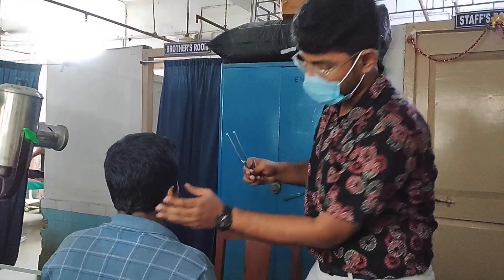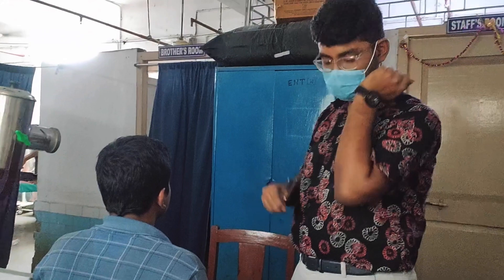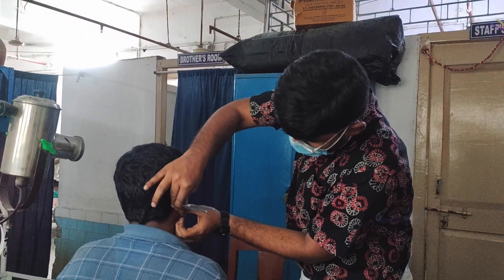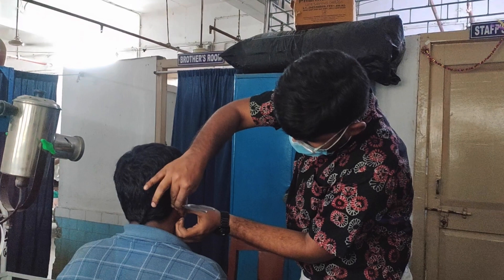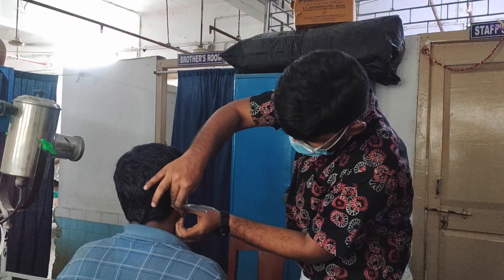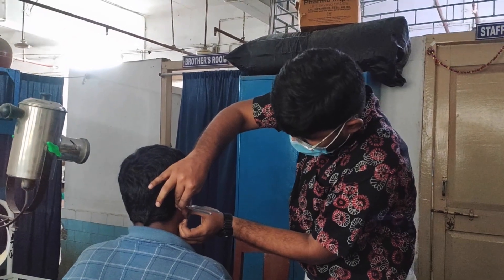Going into the absolute bone conduction test — we put the tuning fork into vibration and place it on the mastoid. The important thing to notice here is that I use my left hand to press the tragus onto the opening of the external auditory canal, so ambient sound is masked. Only the bone conduction sounds will travel; no other sound will travel through the EAC. It is important to always occlude the external auditory canal with the tragus using your other hand. The patient has been properly informed beforehand, so when he can no longer hear, he will raise his hand.